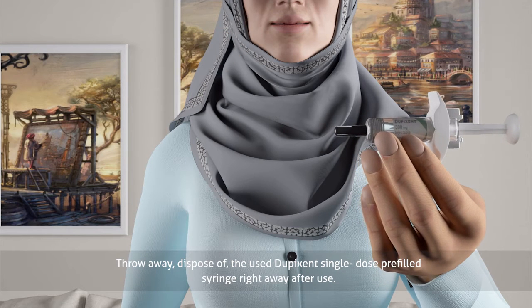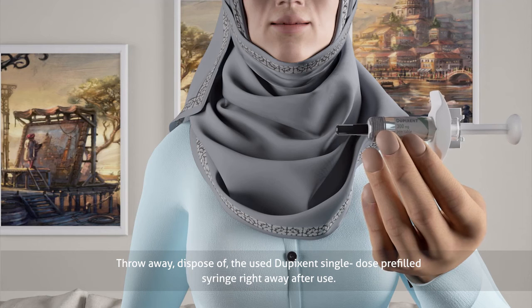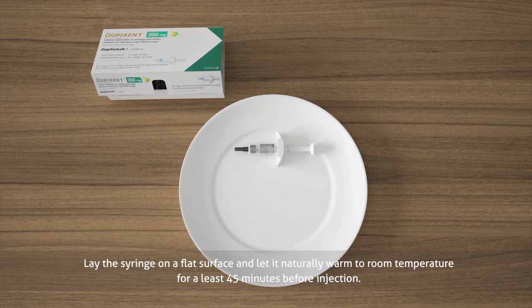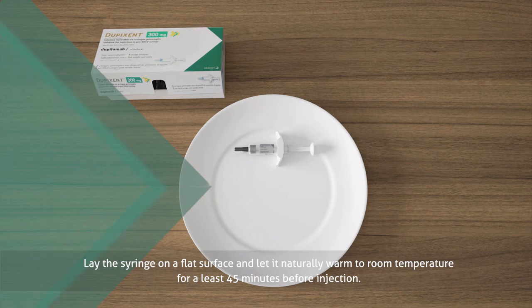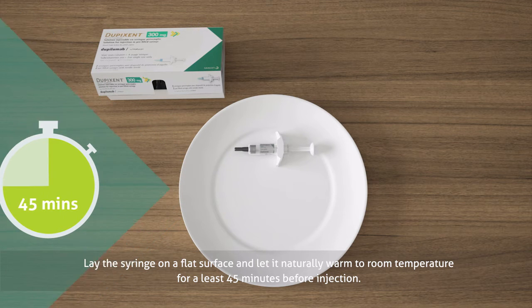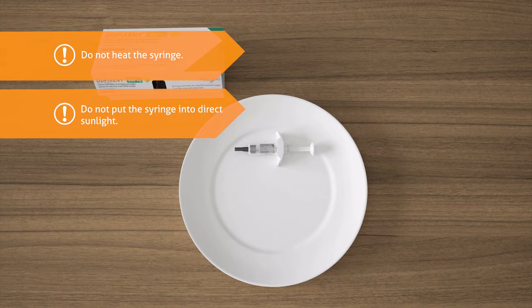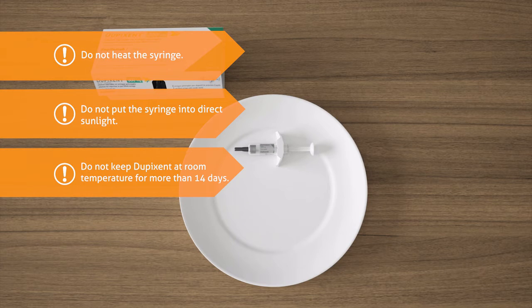Dispose of the used Dupixent single-dose pre-filled syringe right away after use. Lay the syringe on a flat surface and let it naturally warm to room temperature for at least 45 minutes before injection. Do not heat the syringe. Do not put the syringe into direct sunlight. Do not keep Dupixent at room temperature for more than 14 days. Dispose of any syringe that has been left at room temperature for longer than 14 days.